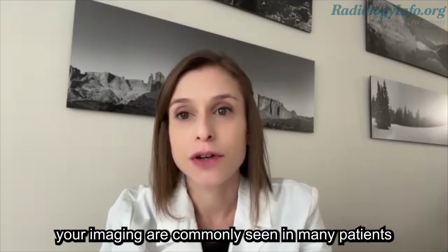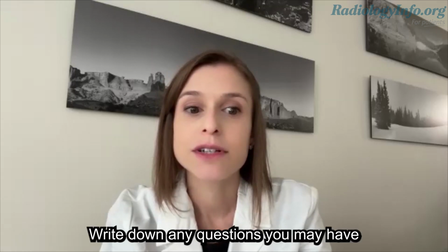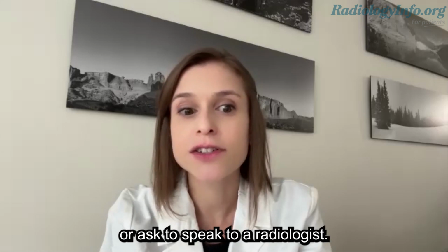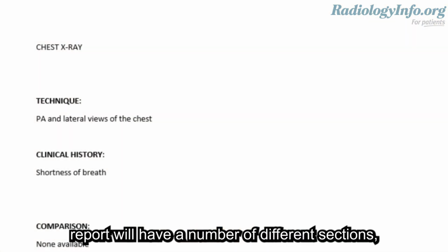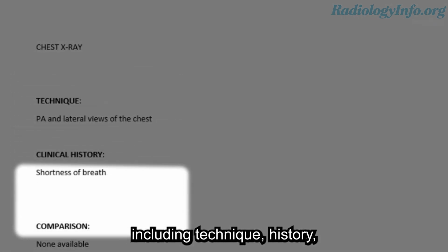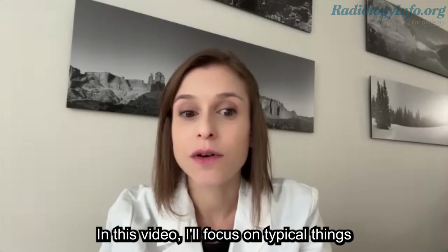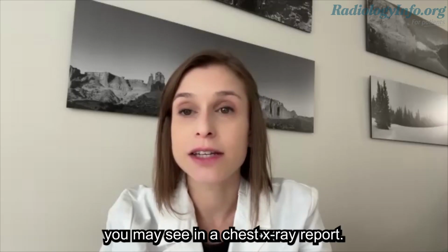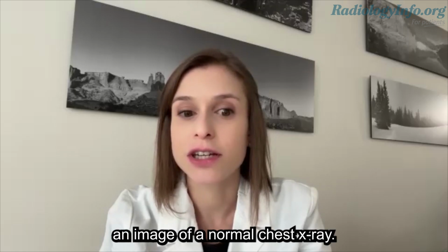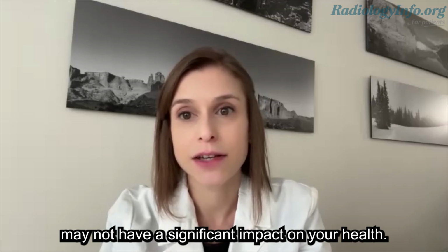Many things that we see on your imaging are commonly seen in many patients and will cause you no harm. Write down any questions you may have and talk to your provider or ask to speak to a radiologist. A typical chest x-ray report will have a number of different sections, including technique, history, comparison, findings, and impression. In this video, I'll focus on typical things you may see in a chest x-ray report. I'll do this by showing an image of a normal chest x-ray. Remember that even some abnormal findings may not have a significant impact on your health.